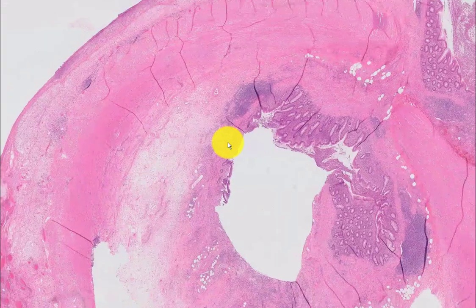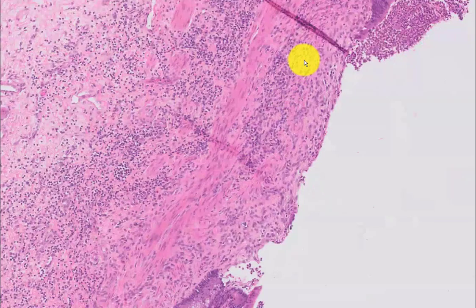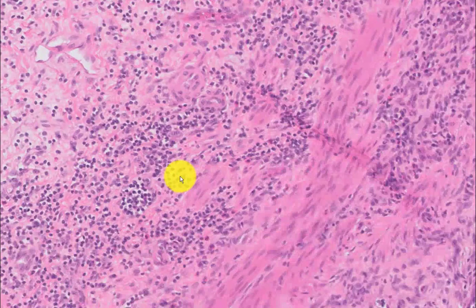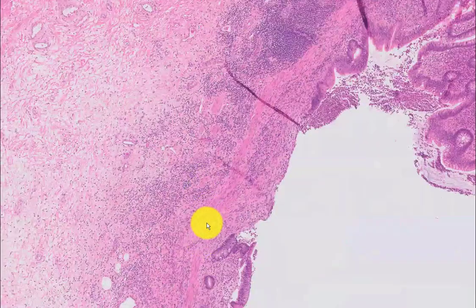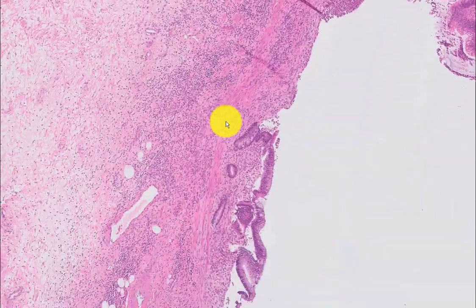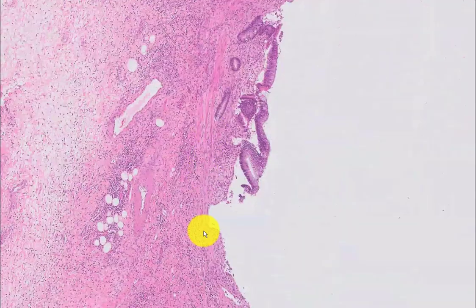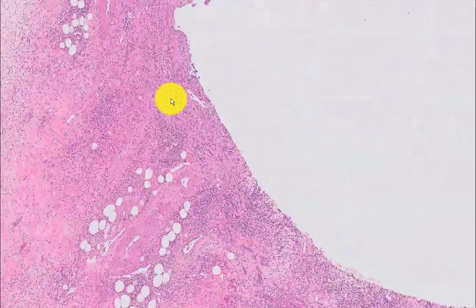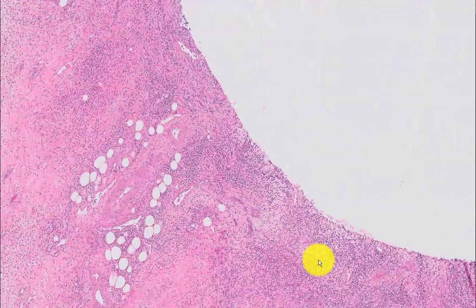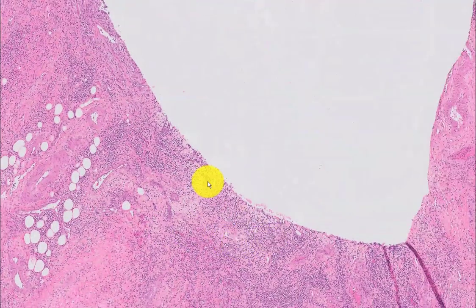Let's move to the other side of the appendix. Clearly there's ulceration of the lining epithelium. Interestingly, the majority of the cells down here are predominantly lymphocytes, not your usual neutrophilic infiltrate that you see with rip-roaring acute appendicitis. Again, total ulceration of the lining epithelium right here.